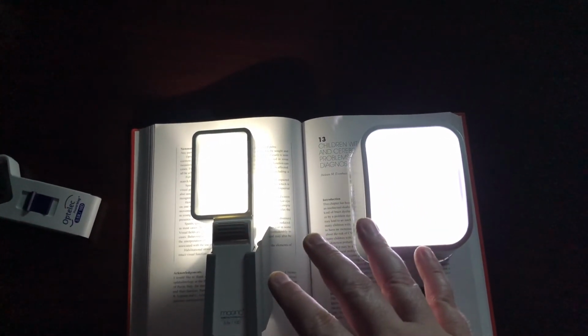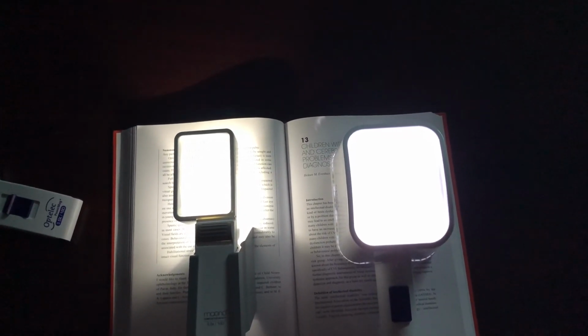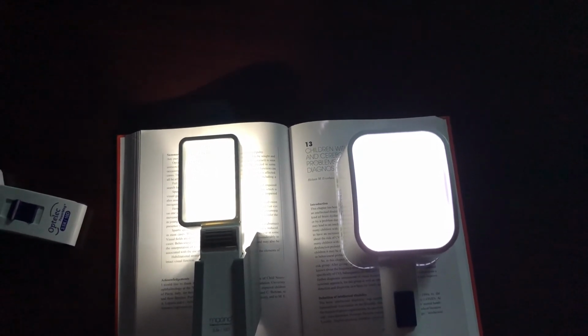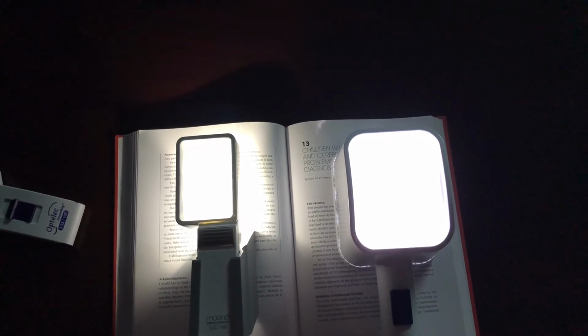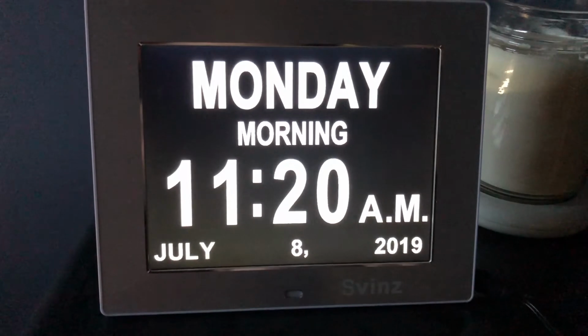We're going to test that theory, and the next slide you're going to see is going to be the time that we start this test, and I will leave them going continually, and we'll check in to see how bright they are after many hours. The time is 11:20 a.m. as we start this demonstration.